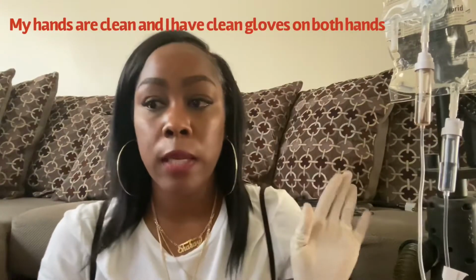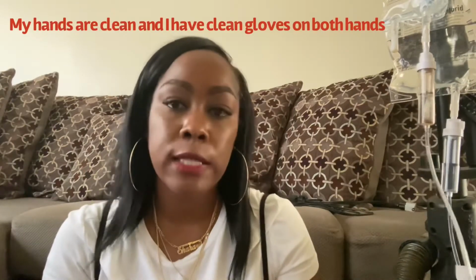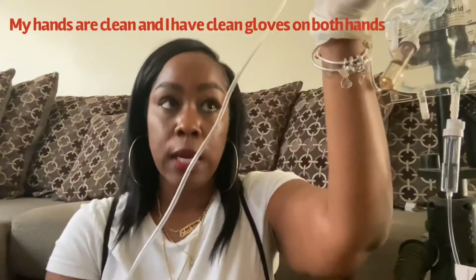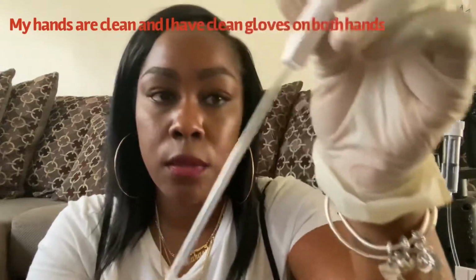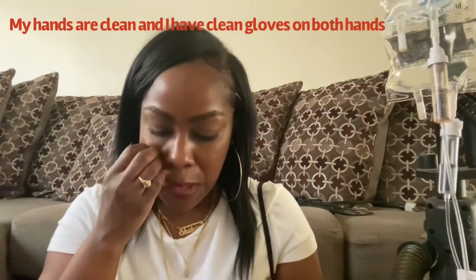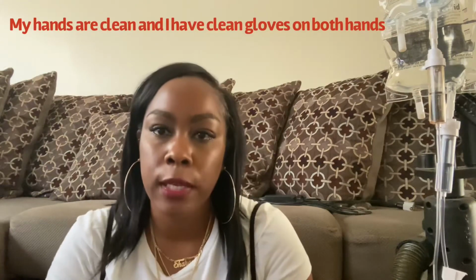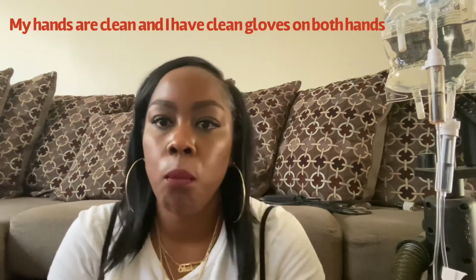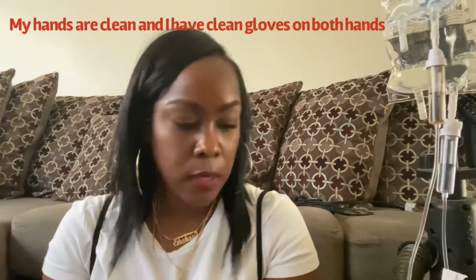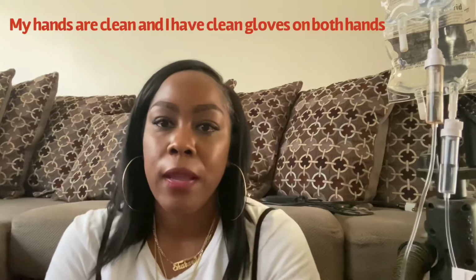And remember at the beginning I already told you that we primed the tubing, everything was primed. I did everything exactly the same as before, where I primed the tubing and made sure that everything was flowing properly. As you can see, I did that. I don't know if you can see it, but of course it's primed, there's fluid in there. Okay, and after everything is administered and connected, of course I regulated the fluid to make sure that it matched what was on the medication order. So I did everything like that. I did everything for my video. Okay, thank you so much.